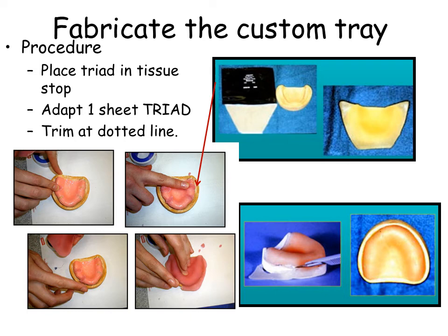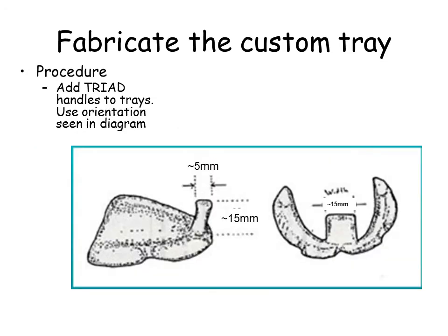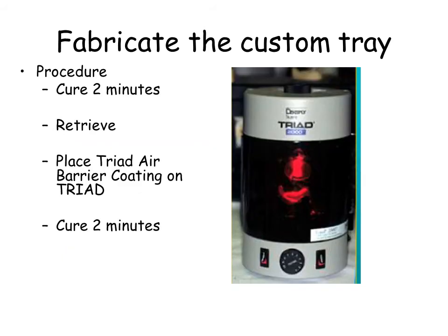Place triad in the area of tissue stops. Adapt one sheet of triad as seen in the diagram, then trim the triad at the dotted line. Add handles as noted in the diagram. Cure the triad as noted in the slide.